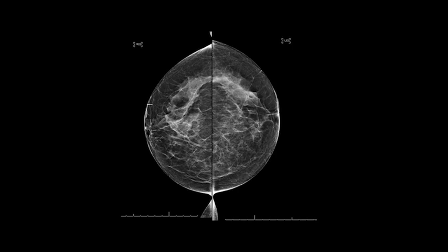You can see what happens. The breast is very springy. Once you let go of it, it can spring right back into the chest wall. You're going to miss that posterior tissue. So that was a good call by the radiologist. They felt it was inadequate, and we're here for the patient. We're not here for the technologist. So it was a good call by the radiologist.